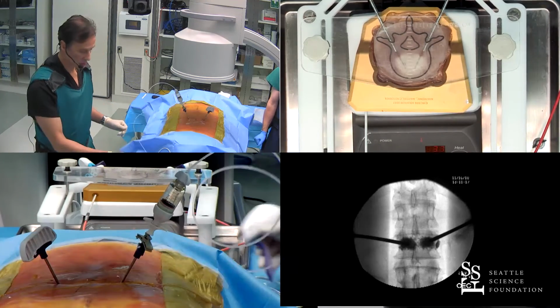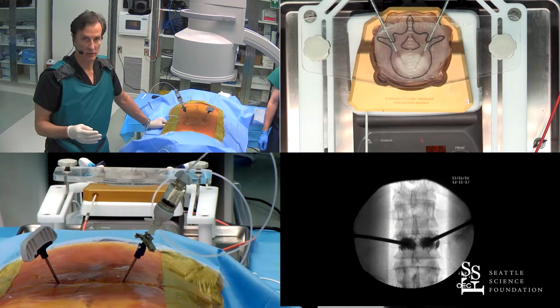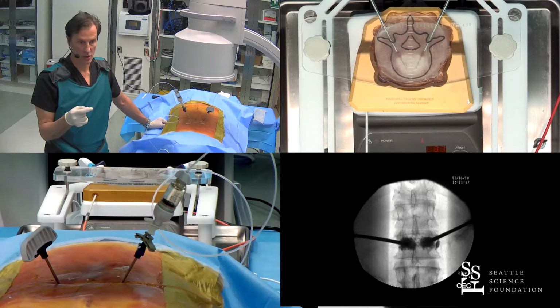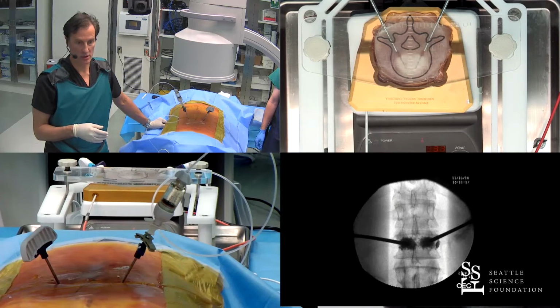And it also, more importantly, predisposes to adjacent level fracture. The more cement you get into the disc space, the more anteriorly it's located, the greater the risk of adjacent level fracture. Brian Peterson and Jesse did a nice paper about this most recently. There are other papers that demonstrate similar things.